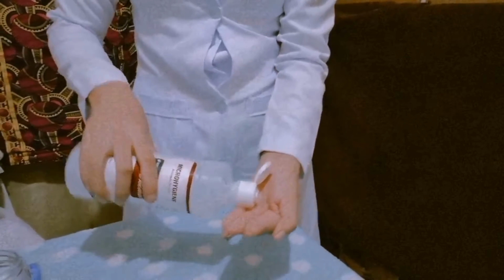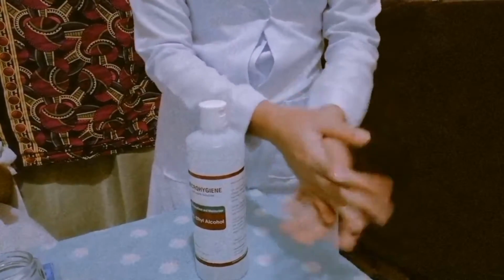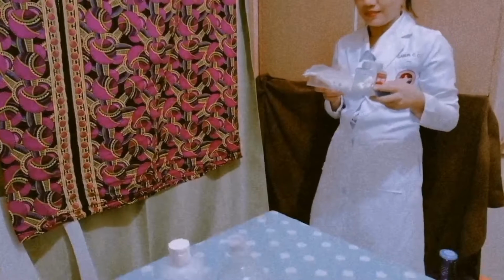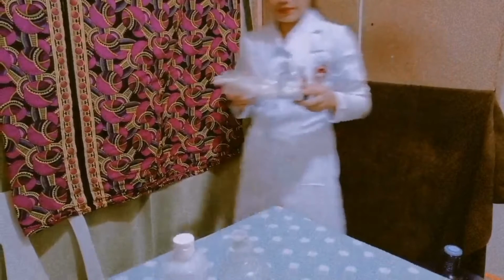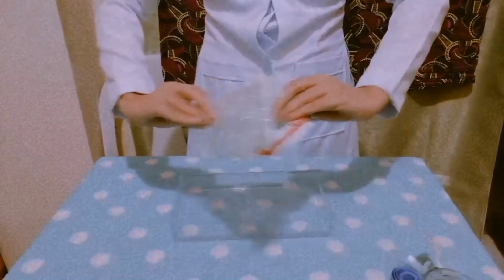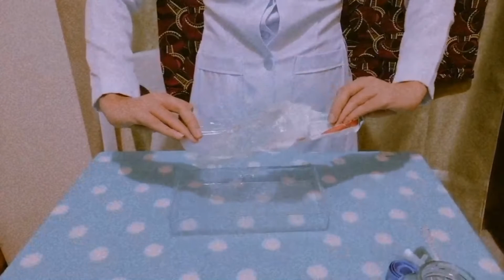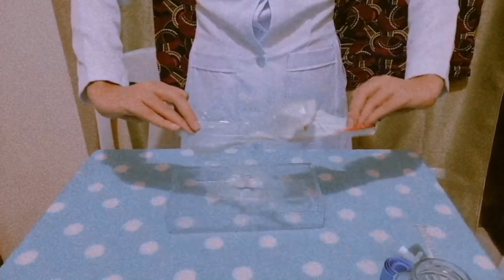The second procedure is wash hands. This prevents the spread of microorganisms. Third is to gather all the equipment and prepare the IV solution and tubing. Having all the equipment available saves time. Maintain aseptic technique when opening sterile package and IV solution. This is to prevent the contamination of IV solution and set which can infect rapidly the client.